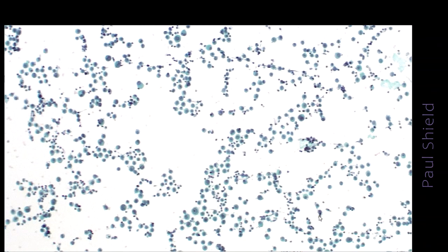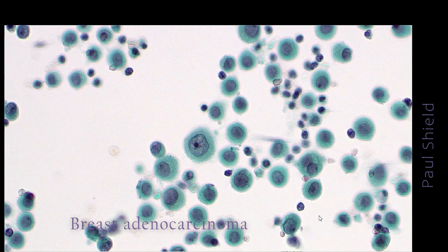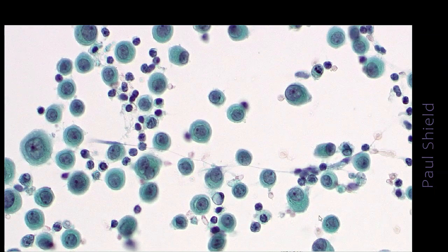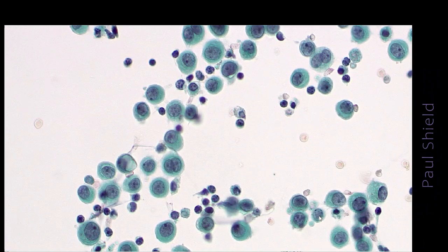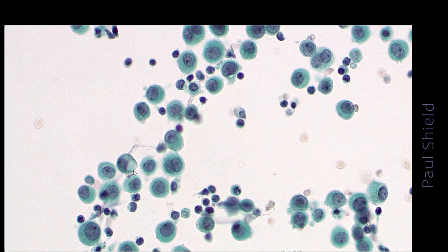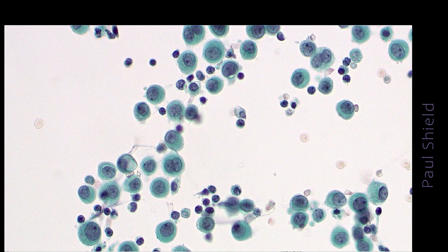This is a pap stain. It's also pretty dispersed. Can't see too many groupings of cells here. On high power again, there's probably more variation in nuclear size than I'd want to see for mesothelial cells. It's quite a big one there. And notice that the cells don't have that lacy border also. And I'm looking around for where cells meet. Are there any windows? And I can't see that typical cell-cell apposition, as it's called. That's typical of mesothelial cells.